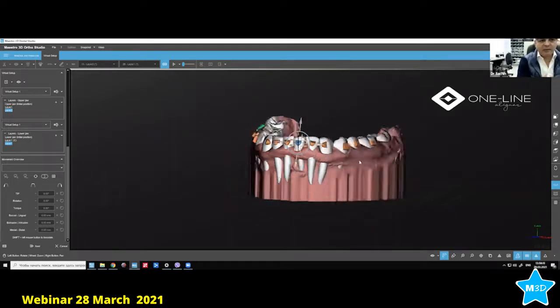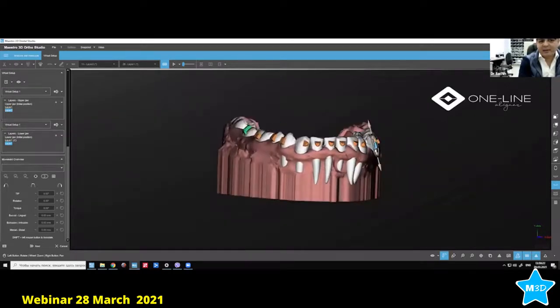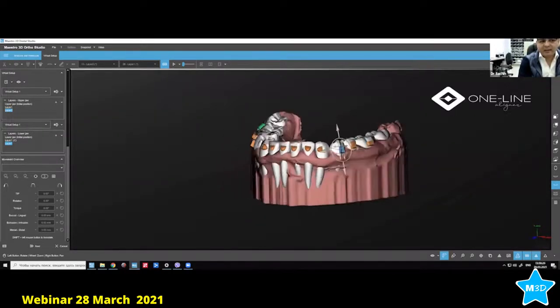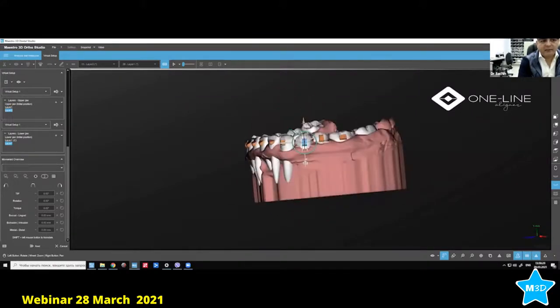So the same way, if you see the rectangular bevel ones, so you have a 90-degree bevel here, and the upper is bevel, right? So if you move them 90 degrees, 180 degrees, right? So the retention has gone almost half. So that is the reason. So when you want retention, you should have the surface which is near the gingiva, which is flat. So the aligner will come and hold, but the upper part will be pressure forming, right? Not which will hold the aligner.